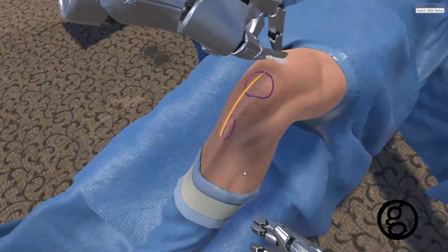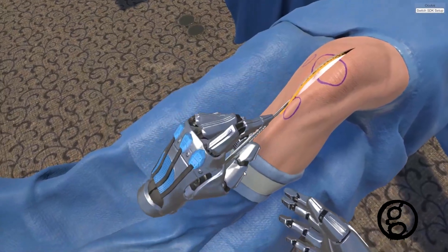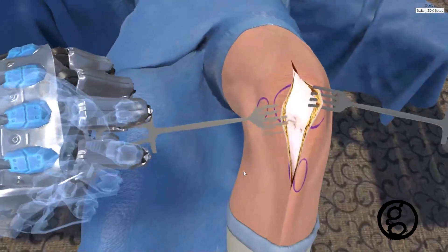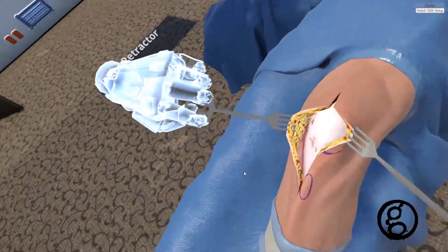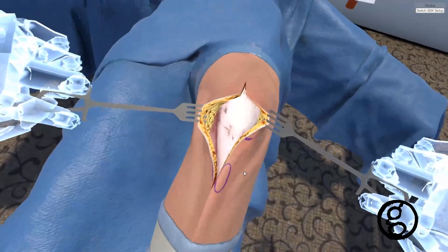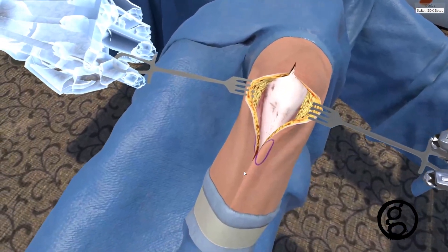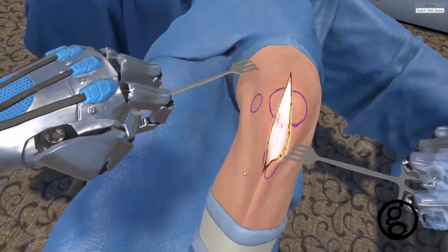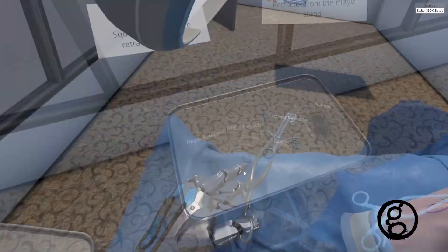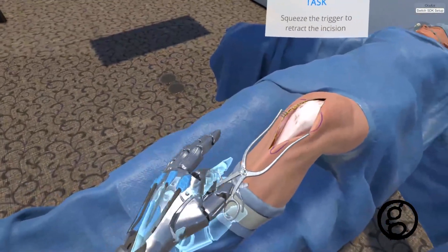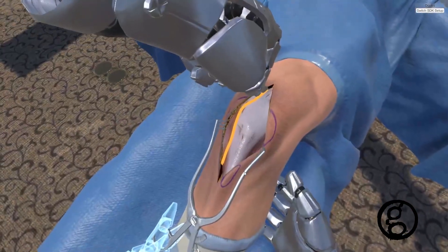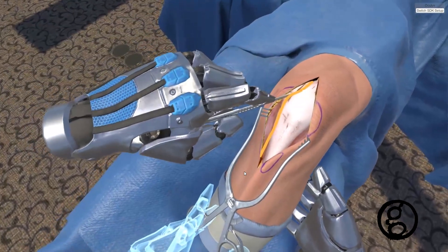You will see a linear highlight on screen. Use the scalpel to make the incision starting along the highlight. Now make an incision in the fascia along the incision highlight. This incision begins just above and medial to the patella.